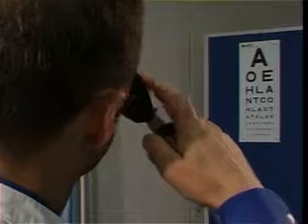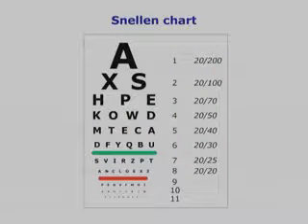A simple way of adjusting the ophthalmoscope to your own vision is to look at the small writing on the Snellen chart and adjust the lenses until it comes into focus. Each line on the Snellen chart is usually labeled with a number. This signifies the distance in meters or feet at which it should be clearly visible with normal vision. The lights should be dimmed to allow for better pupil dilation and to improve focusing contrast.